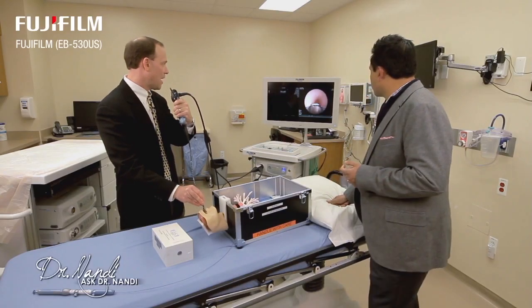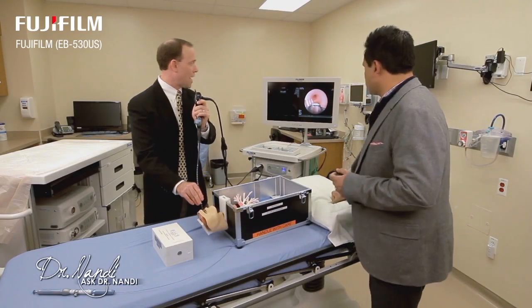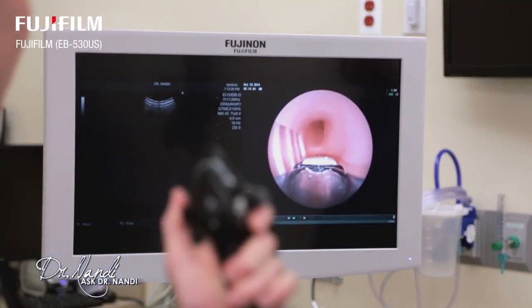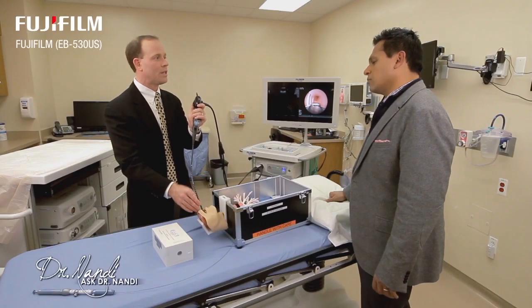And so as you go down, the division point there, you can sort of get a sense. Right here is the right and the left main stem bronchi. And generally we will go down below that, take a look around, make sure everything looks okay, and then we'll come back and try to find our lymph nodes with the EBUS.